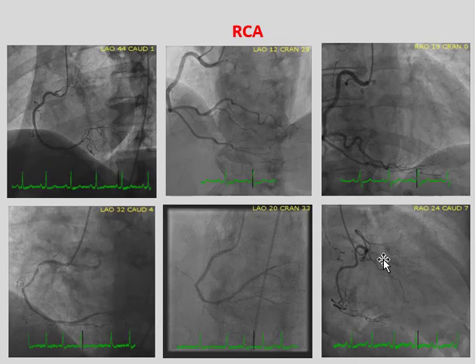However, you can't just memorize all this because vessels have different shapes in different people. This vessel has very tiny distal vessels, this right coronary artery. This would be a non-dominant right coronary. Normally, the left and the right coronaries are equally balanced, but you can have an imbalance, such as the left circumflex can dominate, or the right coronary can dominate.